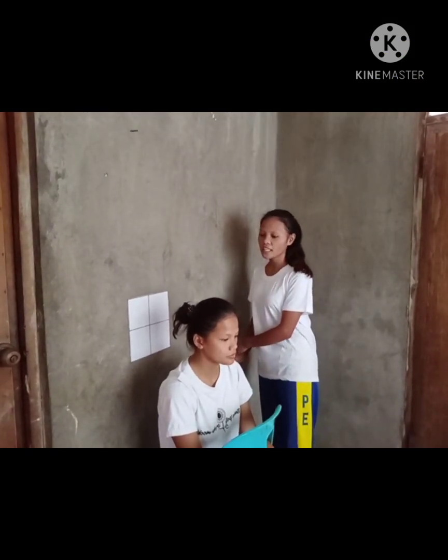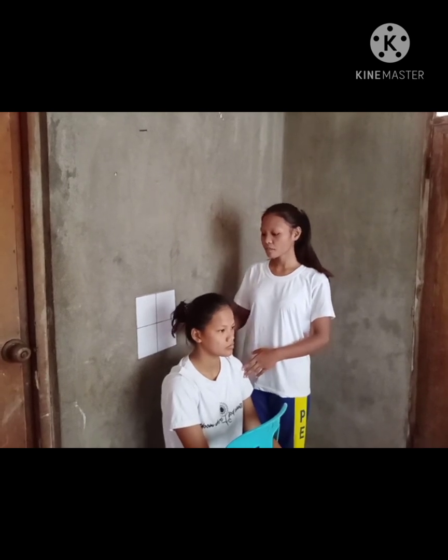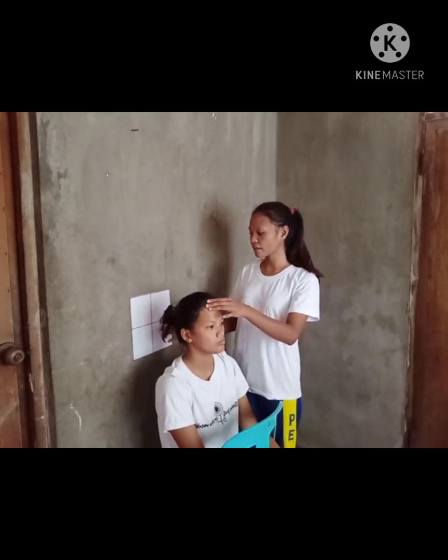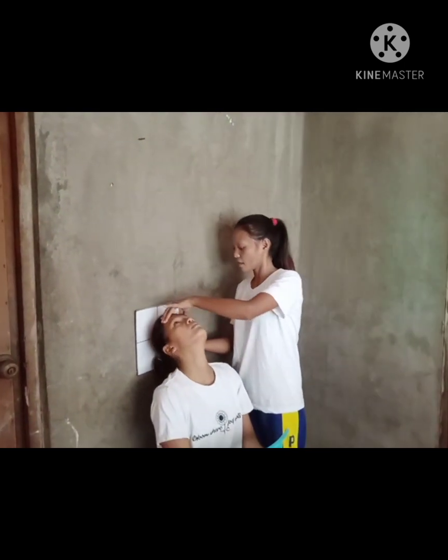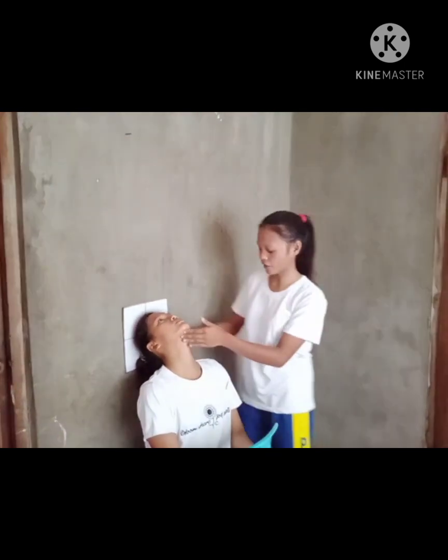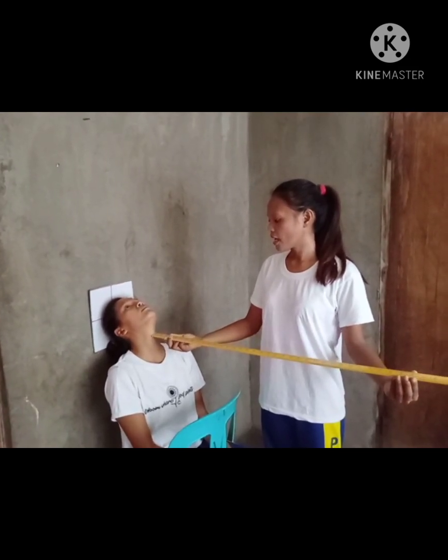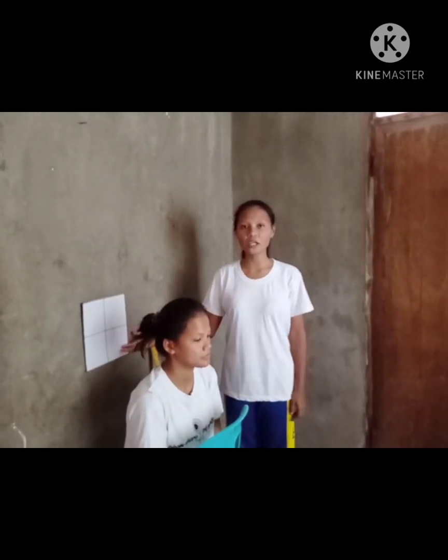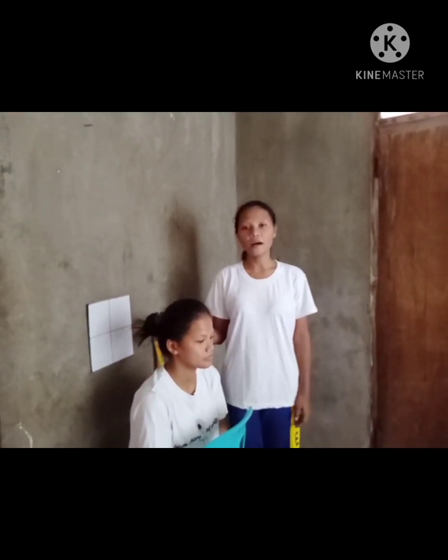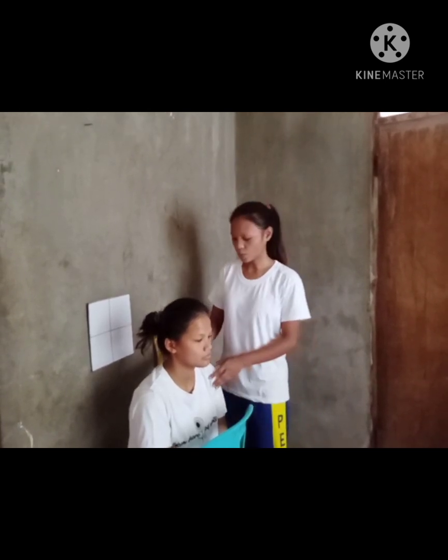Submentovertical projection. Place the patient in seated upright position and ask the patient to move the body away from the cassette. Hyperextend the neck. Ma'am, please extend your neck. Okay. The central ray enters the mid-sagittal plane at the throat, between the angles of the mandible. It demonstrates symmetric images of the petrosal and mastoid processes, foramen ovale, and foramen spinosum.